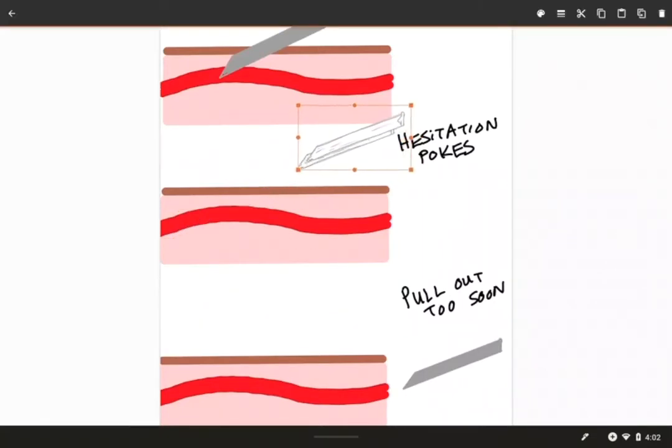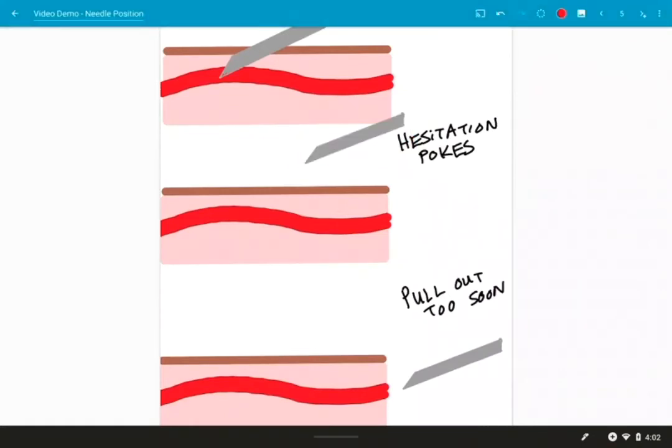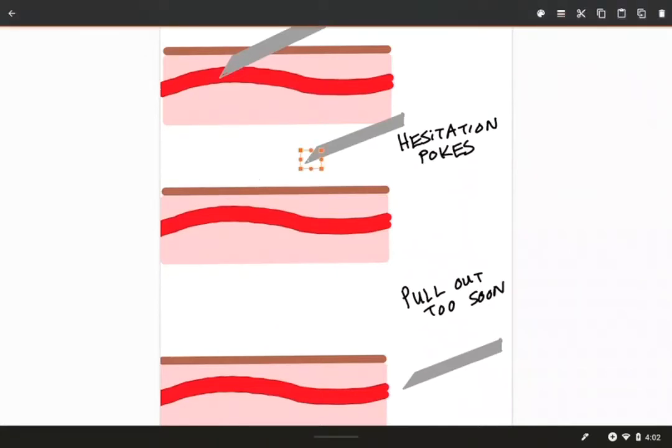Now let's say you are at the appropriate distance. When you're going into a vein, you want to be about maybe a quarter inch, half inch, an inch, away from the site that you're going to go into, because that will avoid shaking hands doing those hesitation pokes.